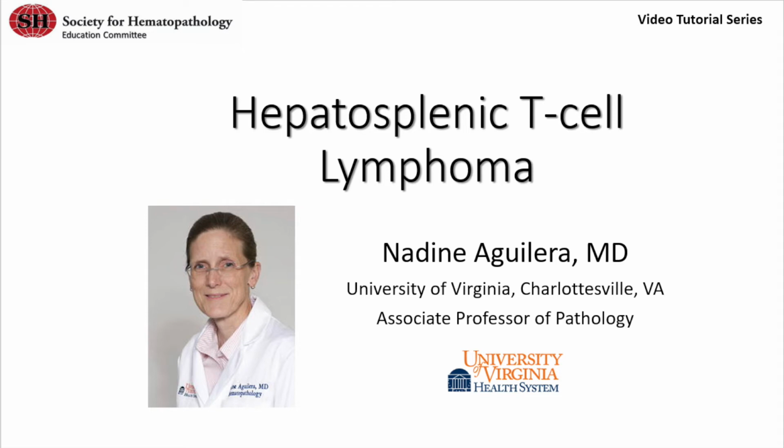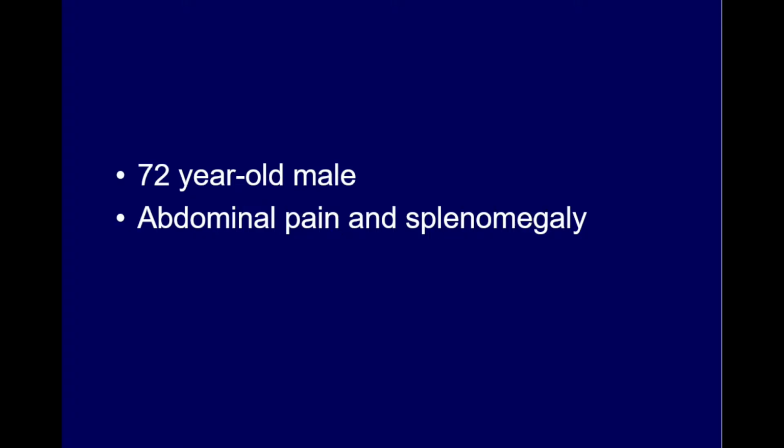Today, Dr. Nadine Aguilera has an interesting case of hepatosplenic T-cell lymphoma with an unusual phenotype. Dr. Aguilera is an associate professor of pathology at University of Virginia, and she's also the Hematopathology Fellowship Program Director and Division Director. Today we're going to look at a spleen.